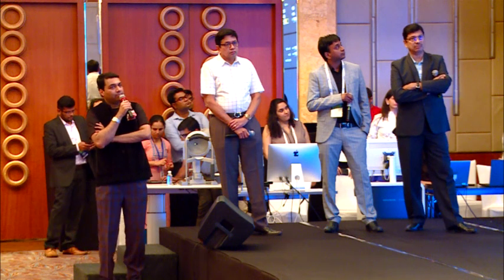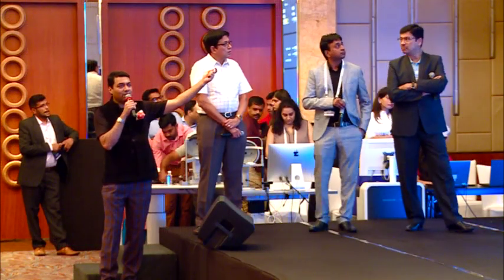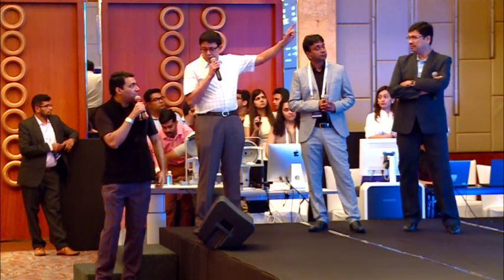In this case, I'll go midway between the 2 cylinders. So you do a mean of 2? Do a mean of 2. If you take a mean of 2.25 and 3.87, let's assume 3.25, approximately. So write 3.25. Since I'm overcorrecting the cylinder by a diopter, I would undercorrect the sphere by half a diopter. So you would give minus 1. Now on minus 1, I would apply the nomogram. Let's assume this is nomogram based. On minus 1, I don't think there's much nomogram. Overcorrect by quarter, 0.25. I think it should be plus 0.5.